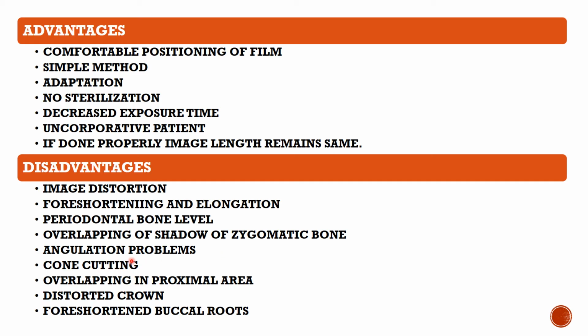The horizontal and the vertical angulations have to be assessed for every patient, and considerable skill is required. So you require good skills to take a proper radiograph through this bisecting angle technique.